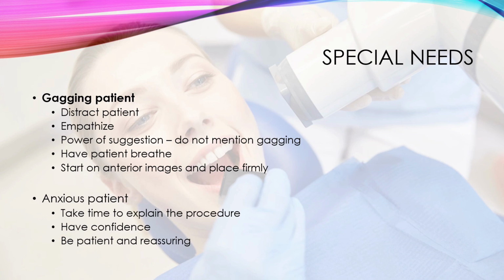We don't only need to evaluate a patient to determine what type of x-rays that this patient needs, but also to determine what type of approach that you will need to take for this individual. Some patients are super comfortable at the dental office, while others are very anxious. On an anxious patient, we will need to take the time to explain what we are doing and to put them at ease. Confidence and efficiency are two of the best attributes of a dental assistant radiographer. In addition, encouraging your patient along the way makes the process of taking x-rays a little bit easier on everyone.